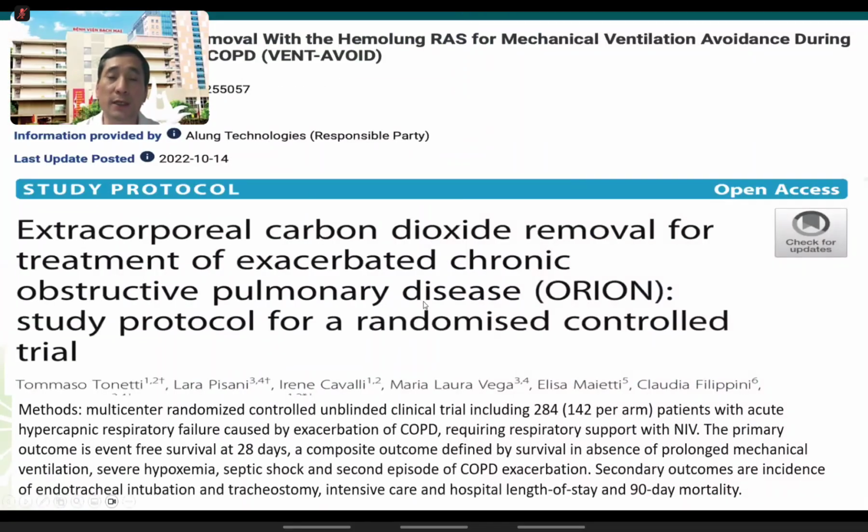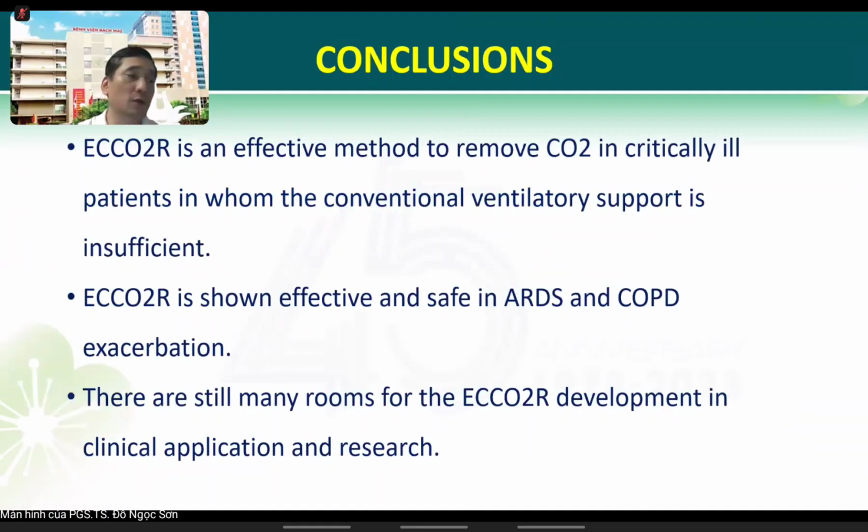And recently they have started studies like this and are already waiting for the result. I hope that it has a positive result for COPD patients. So in conclusion, CO2 removal is a very effective method in many ICU patients. And of course, it's safe because we use a low flow system, and a lot of CRRT machines can take care of that.